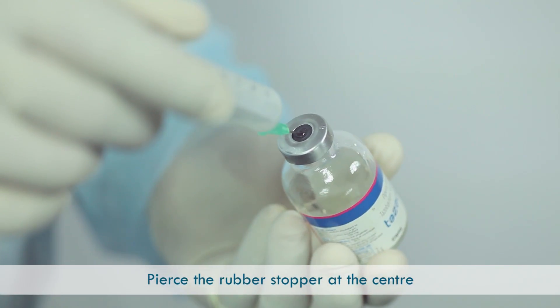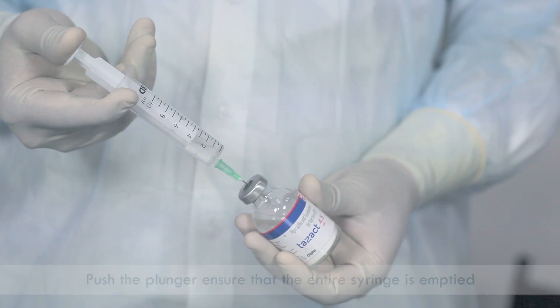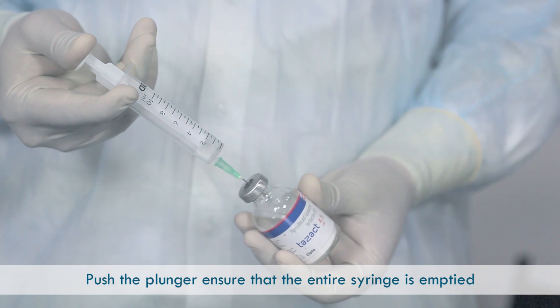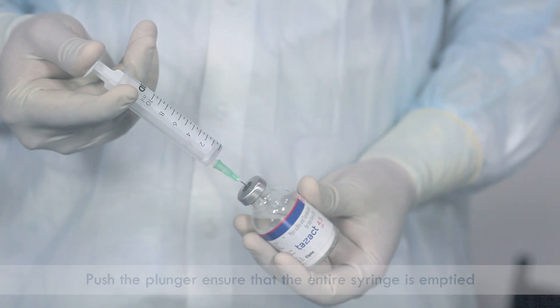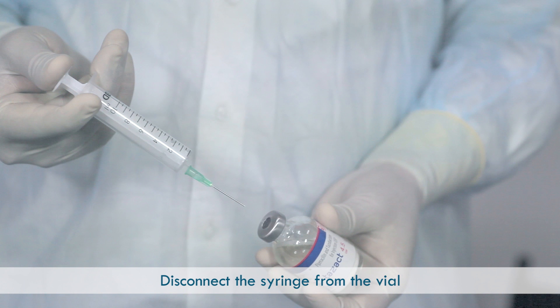Open the drug vial by twisting off the top. Pierce the rubber stopper at the center and allow the water to be drawn into the vial. Push the plunger to ensure the entire syringe is emptied. Disconnect the syringe from the vial to break any residual vacuum and avoid dilution of the anti-infective.